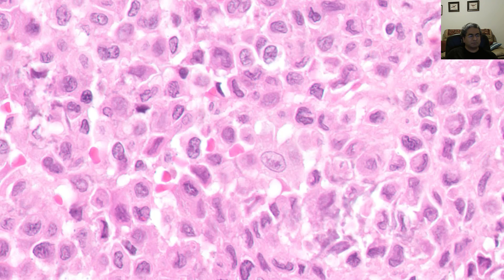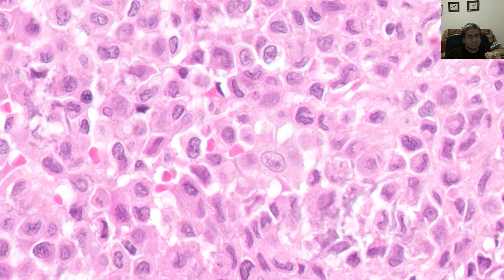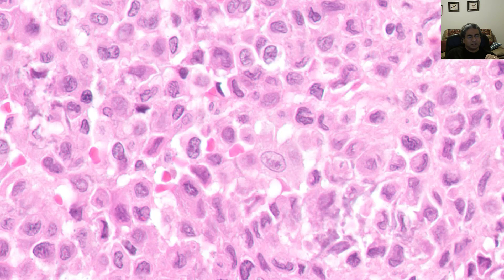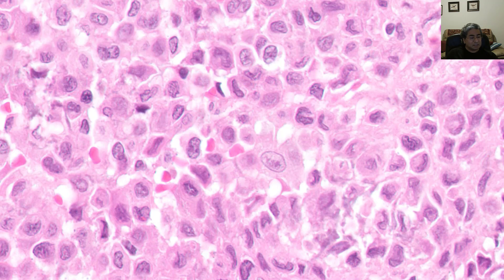This is the key cell of chondroblastoma. The cells have abundant dense eosinophilic cytoplasm and distinct cytoplasmic membranes. But it's the nuclei that are most characteristic — they are oval and very vesicular. You do not see prominent nucleoli, but you do see very prominent grooves. They often remind me of Langerhans cells.